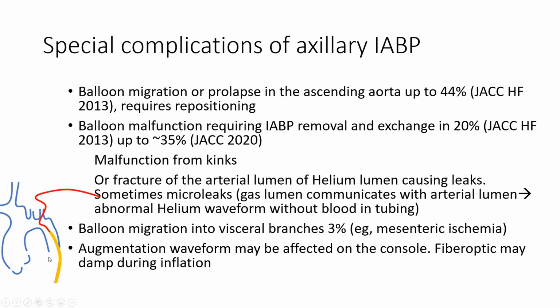Another special complication is balloon tip, that distal marker here, migrates into the visceral branches. This was seen in 3% in that Methodist series. That's unlike the femoral balloon pump, where the tip is not going to migrate into small branches. This one, the distal tip, can migrate into small abdominal branches, such as mesenteric or lumbar arteries, and it can cause ischemia or perforation and bleeding.